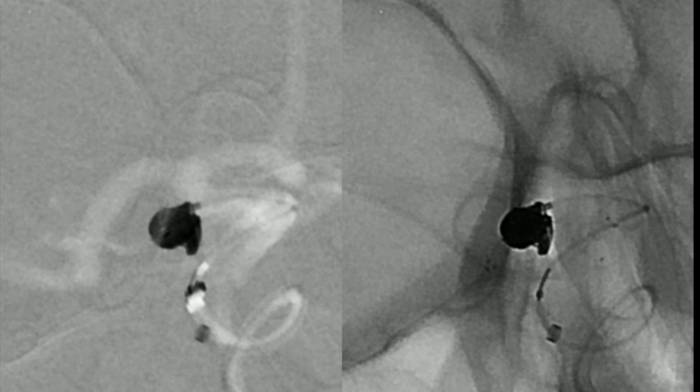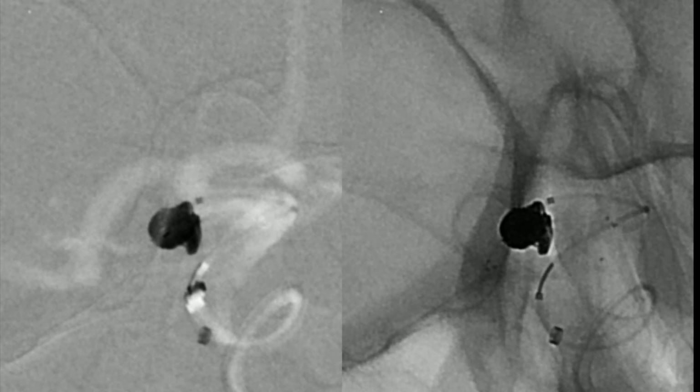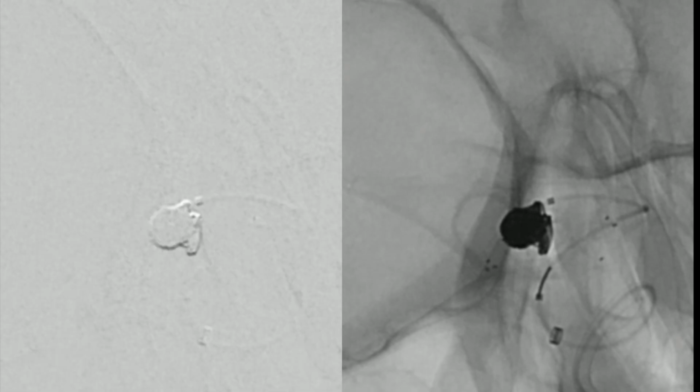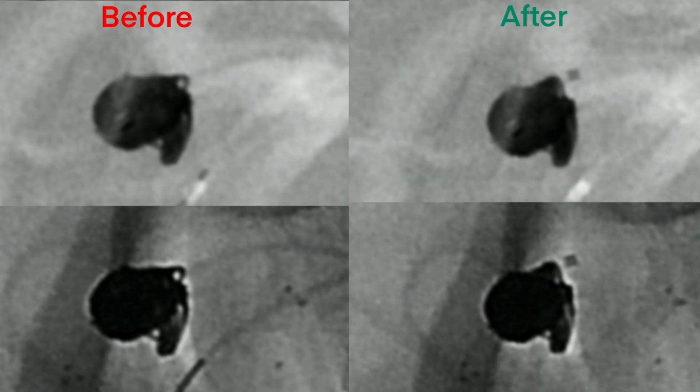And now we are inside the aneurysm sac. And as you can see, we've corrected the position of this coil loop. And this is here a comparison before and after the correction of the position of this loop.